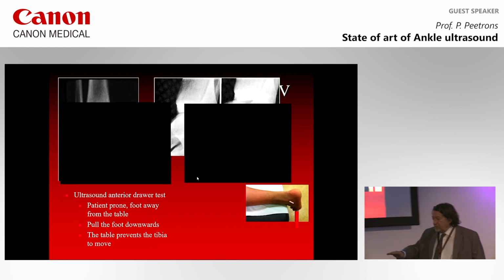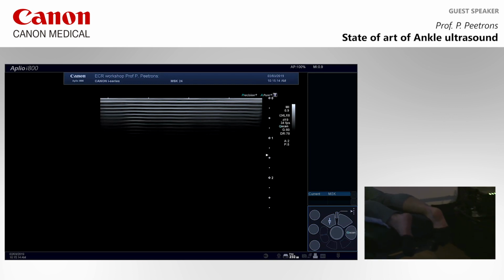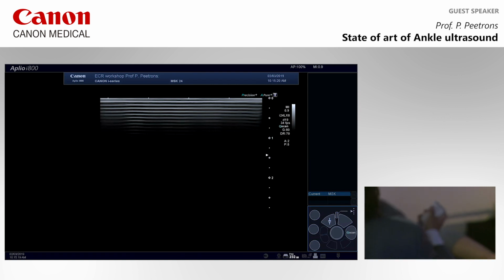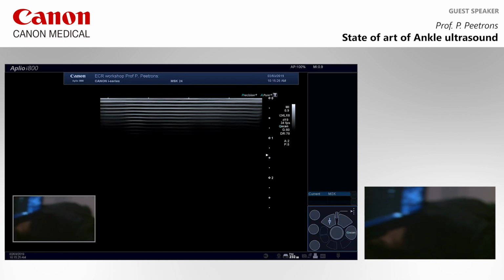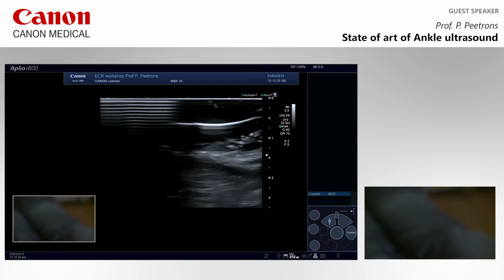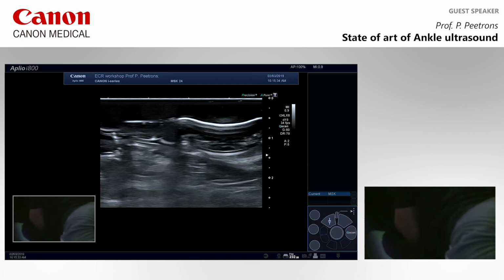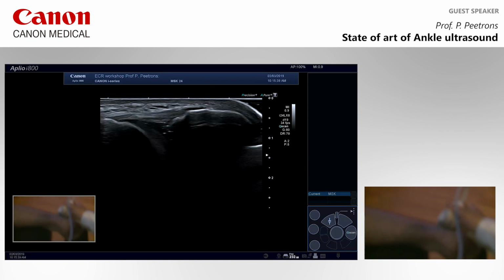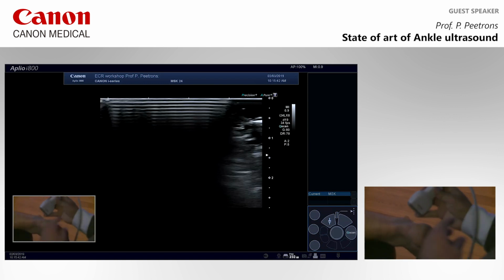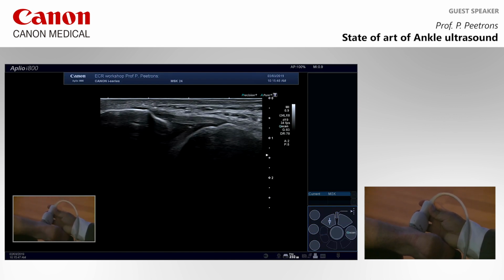So can you lie prone? I take this one. So I take a high frequency probe, which is big. We can also take the hockey stick probe. I put his tibia on the table. I put my probe, I will do this one so you can see a little bit better. I put my probe on the ATFL. You can see on the left now the fibula, and on the right you can see the talus, and you can see the ATFL in the middle.